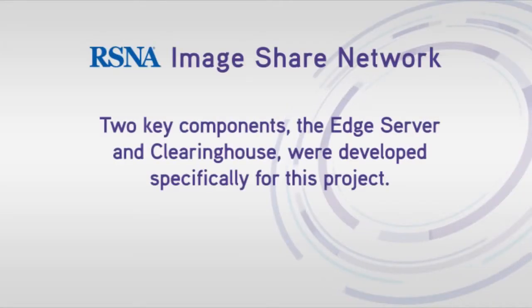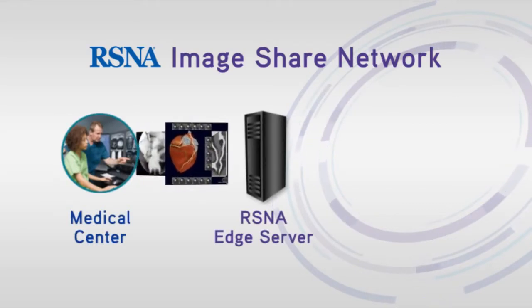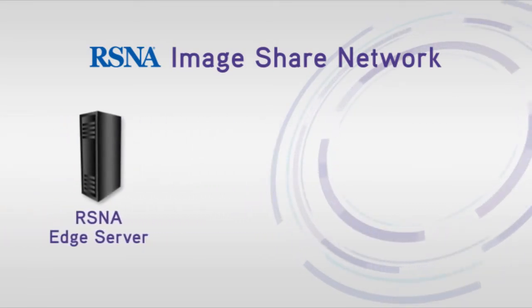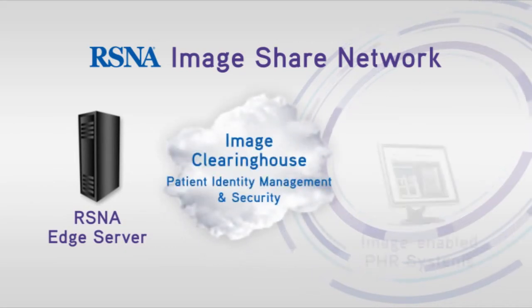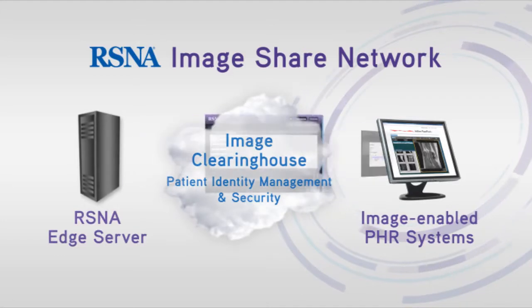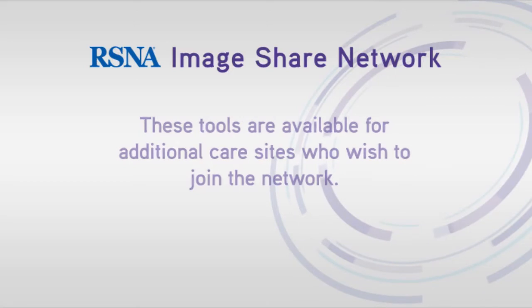Two key components, the Edge Server and Clearinghouse, were developed specifically for this project. The Edge Server gathers the imaging studies and reports of participating patients and sends them in a secure electronic format. The Clearinghouse receives the studies and makes them available for retrieval by image-enabled PHR systems. These tools are available for additional care sites who wish to join the network.